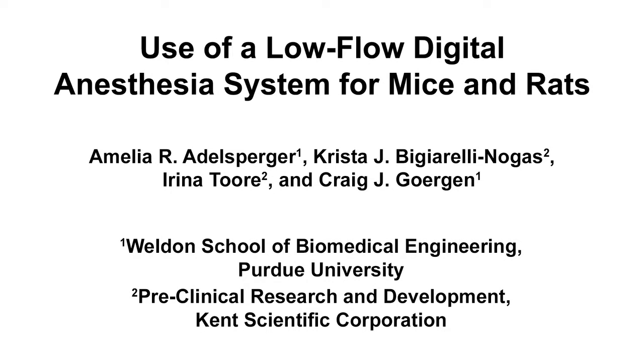This protocol demonstrates the use of a syringe-driven direct injection vaporizer as part of a digital low-flow anesthesia system. The direct injection vaporizer accurately delivers anesthesia at very low flow rates compared to a traditional vaporizer, making it a promising alternative for controlled anesthetic delivery to rodents.